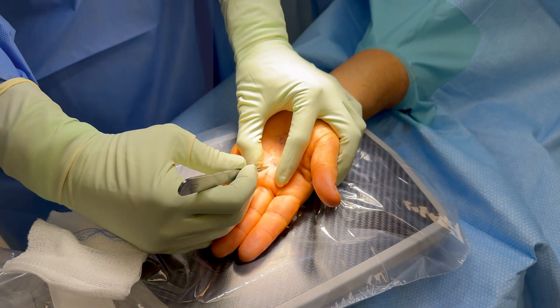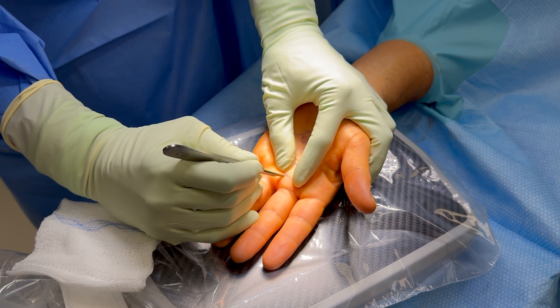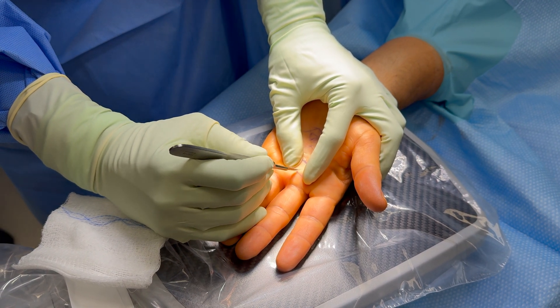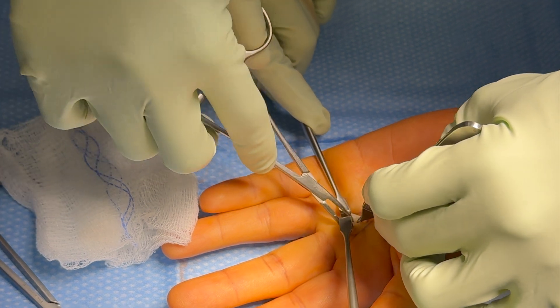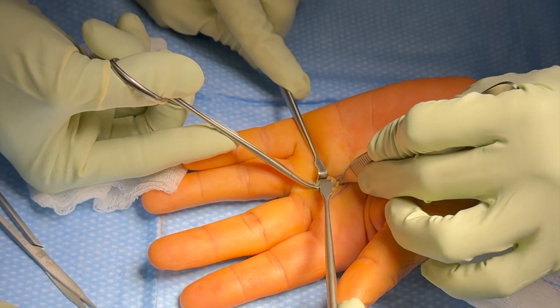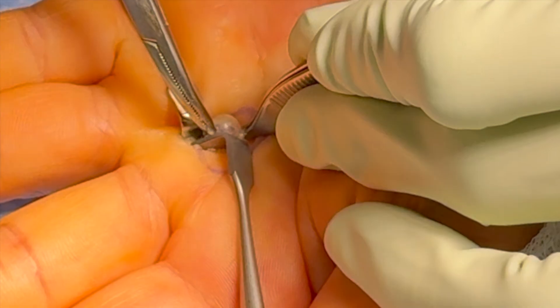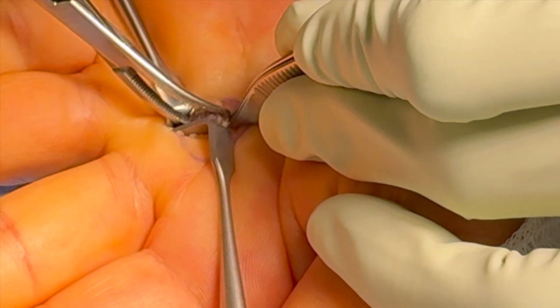Here we are making our incision. We typically use a 15 blade scalpel and we just make a small stab wound directly over the pellet. We then perform blunt dissection down to the pellet and sort of separate it from the surrounding tissues. We're using a mosquito type clamp right now to do the dissection.